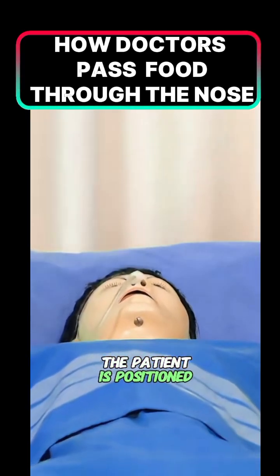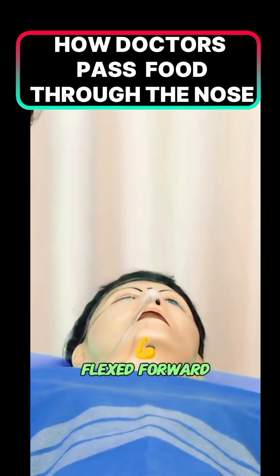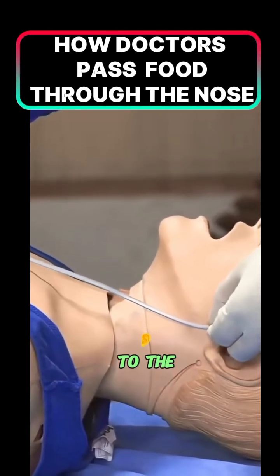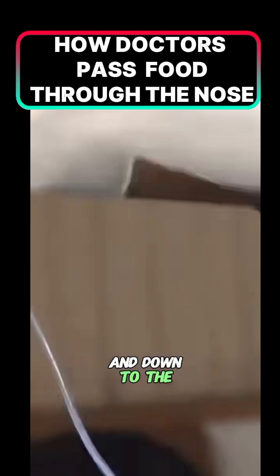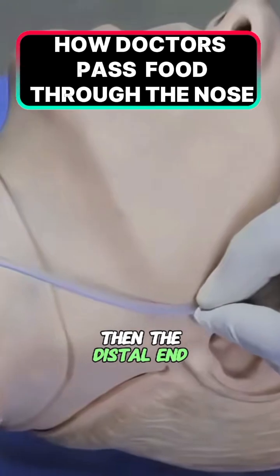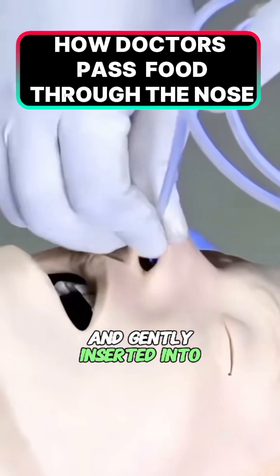The patient is positioned in a high Fowler's position with the head slightly flexed forward. The tube length is measured from the nose to the ear and down to the xiphoid process and marked. Then the distal end is lubricated with water-soluble jelly and gently inserted into the selected nostril.